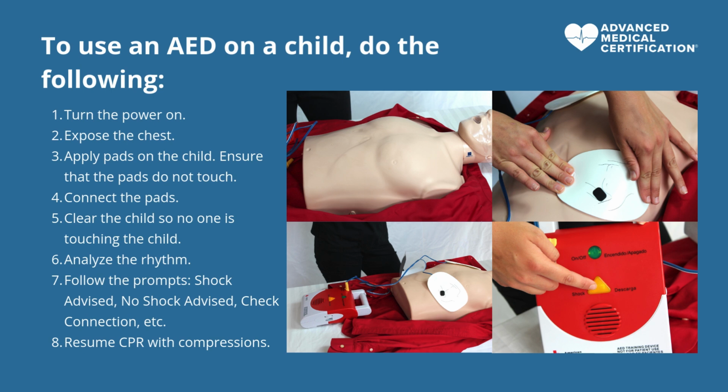Analyze the rhythm. Follow the prompts. Shock advised, no shock advised, check connection. Resume CPR with compressions.